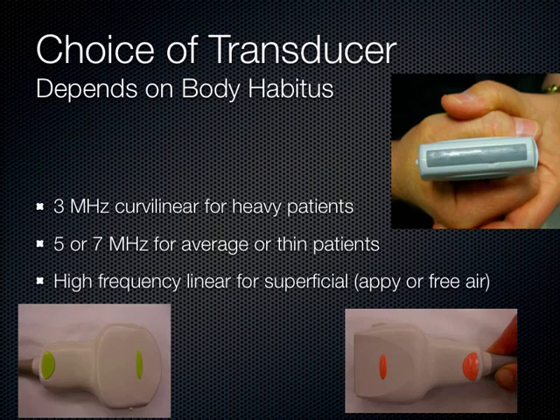So when you look at the bowel intestines with ultrasound, like everywhere else in the body, you want to try to use the highest possible frequency so you get the best possible resolution, as long as you can penetrate to the depth of interest. And so usually on most patients with the bowel, like for the appendicitis and stuff, we use this linear probe. That gets us our answer almost all the time, which is great because it's high frequency. Occasionally we have to use the lower frequency, in this case the curvilinear probe, down in that 3 megahertz range if we have to. In a larger patient, we have to turn to this transducer sometimes, but almost always I can get by if I push hard enough with the linear transducer. We get really nice images.